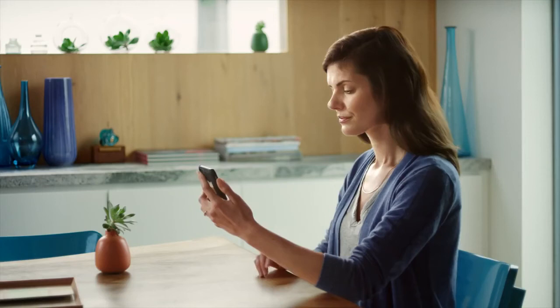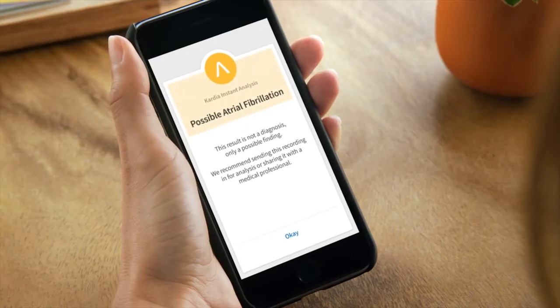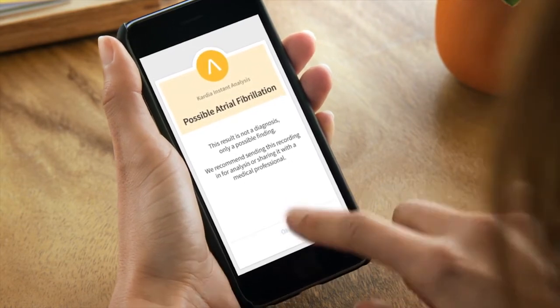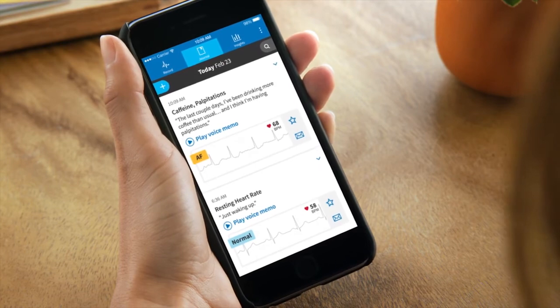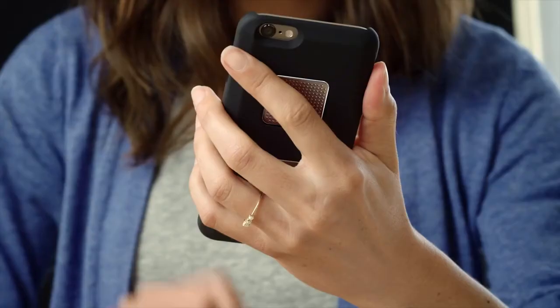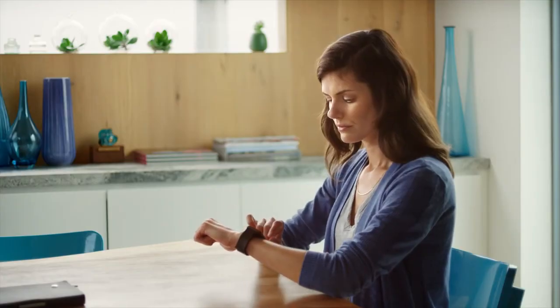If heart rhythm is normal, you'll know right away. And if atrial fibrillation is detected, your EKG can be shared with your doctor immediately. When the journal appears, you'll see your EKG and analysis results. From here, you can play your voice memo back, review and edit your EKG, or send your recording to your doctor.